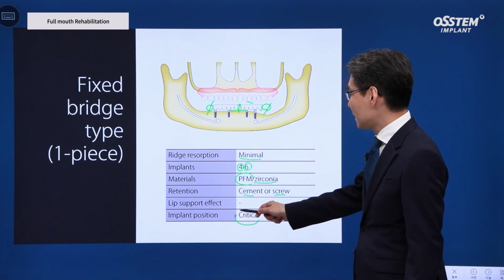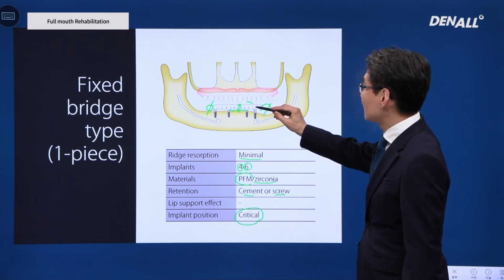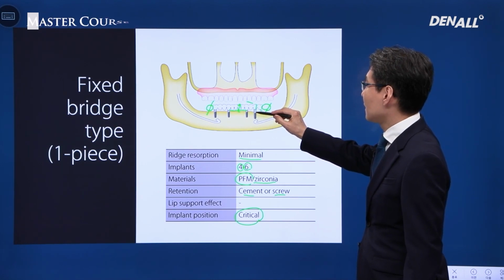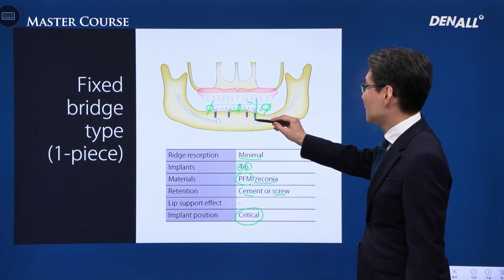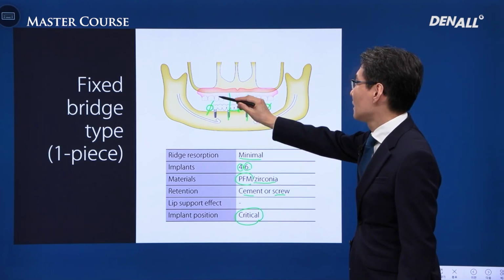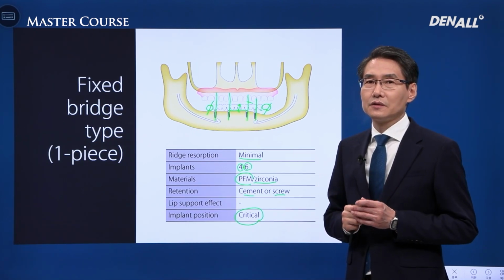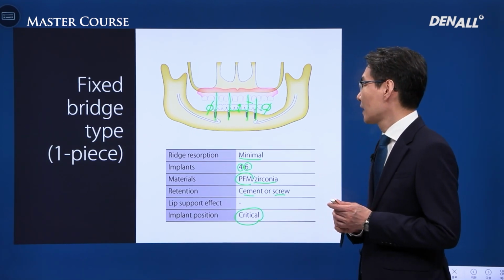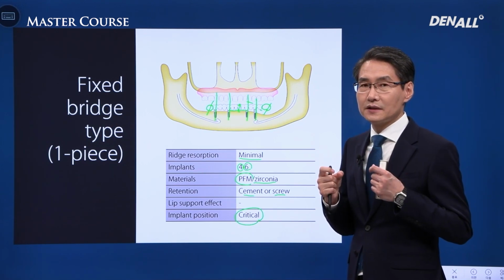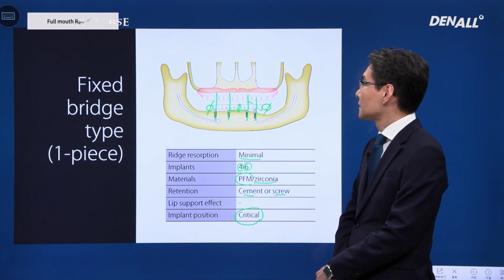Implant placement position is very important. As mentioned earlier, the crown length is short. So, it is very important to place the implant accurately to allow for easy prosthodontic phase and good prognosis. In order to place implant accurately, guided surgery can be used.